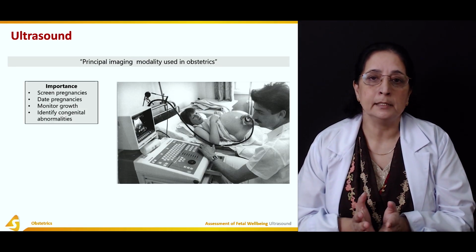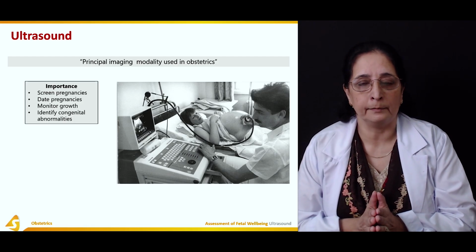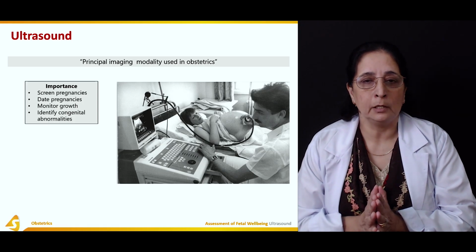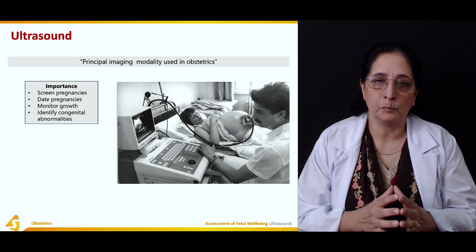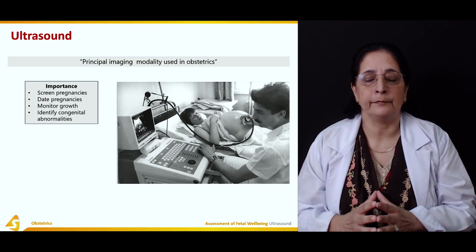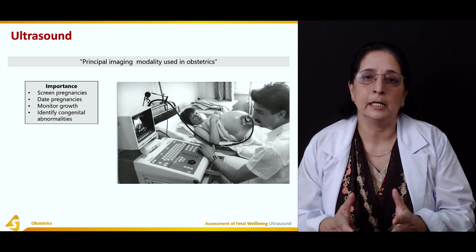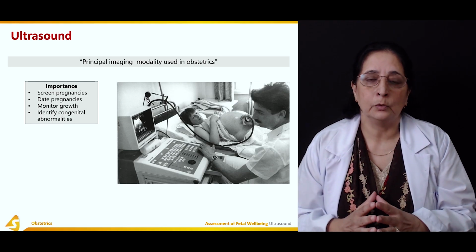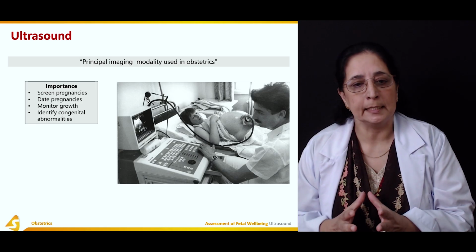Then it is used to monitor the growth of the fetus. This is important because if the growth is not normal, if it's a small for dates baby or a large for dates baby, different conditions can cause this and they can be managed, so as to avoid any complications at birth and delivery.